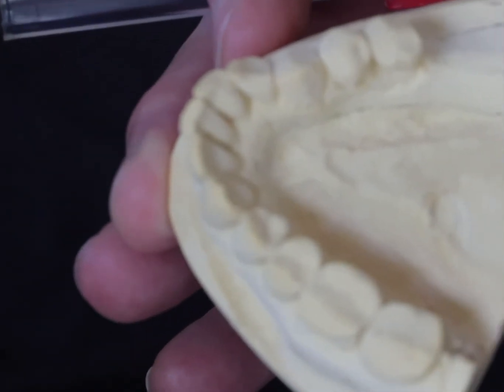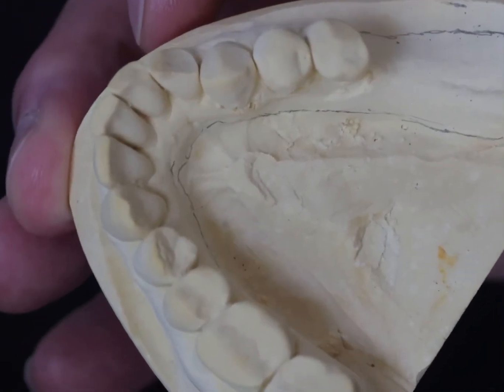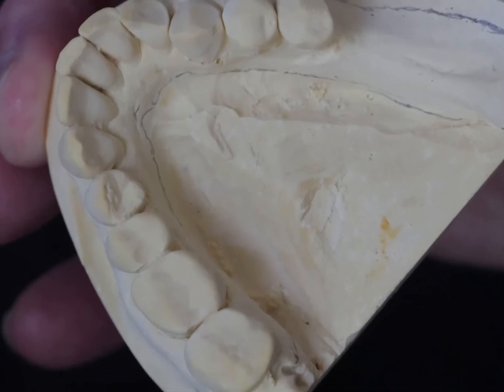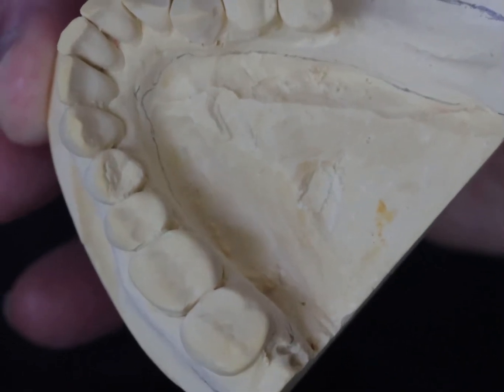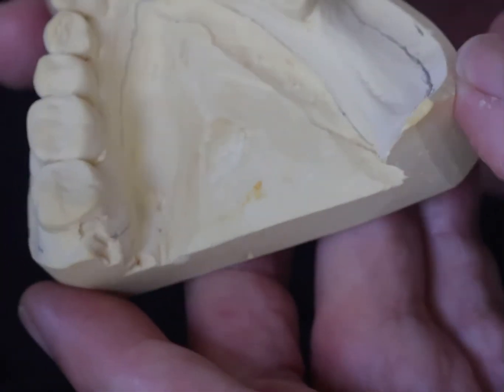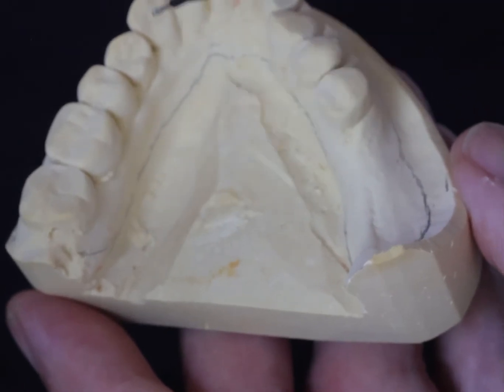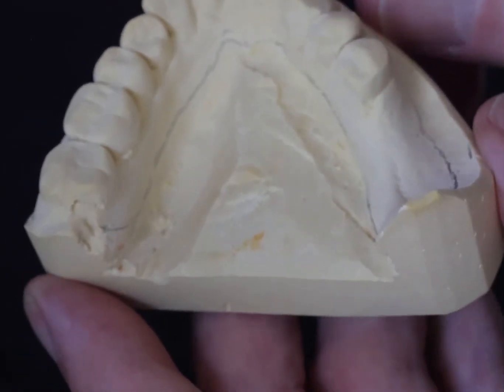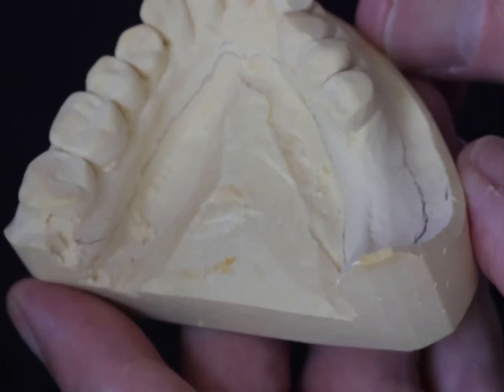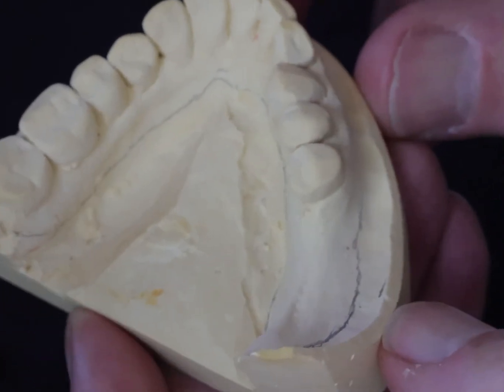This is tricky — you have to hold this in the middle of the frame so you can see the frenum area. You cannot afford to squash the frenum area, otherwise you'll just get problems. Lingually on the other side, just take the tray short of the sulcus so you can add green stick to get the functional sulcal depth. Don't let your tray dictate the lingual sulcus.